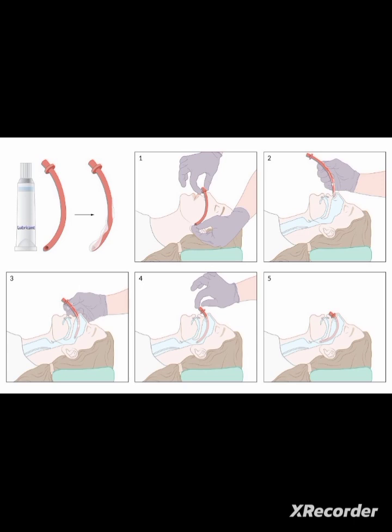Consider a topical decongestant to decrease the risk of epistaxis, like oxymetazoline. Then select the wide nostril, insert gently without forcing. Aim posteriorly, not superiorly. Then twist the tube back and forth for ease of passage. If resistance is encountered, stop the attempt and start on the contralateral nostril.